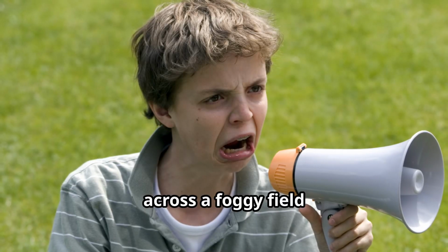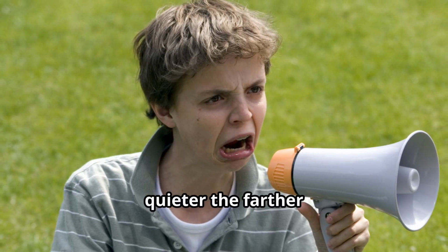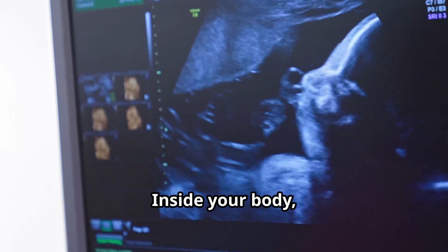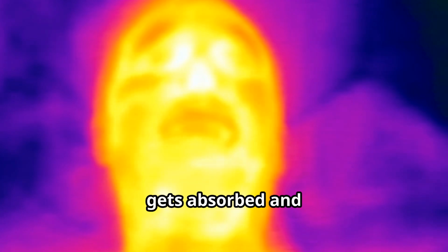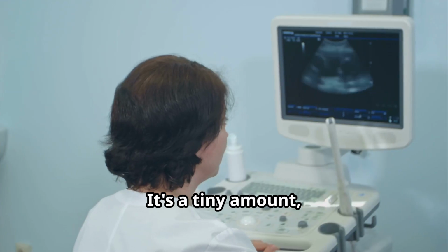Imagine yelling across a foggy field. Your voice gets quieter the farther it goes. Inside your body, the same thing happens to ultrasound waves. Some of that energy gets absorbed and turns into heat. It's a tiny amount, but it matters. Absorption is just the beginning.